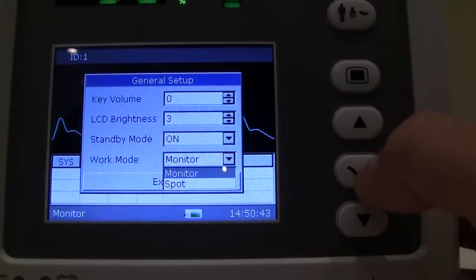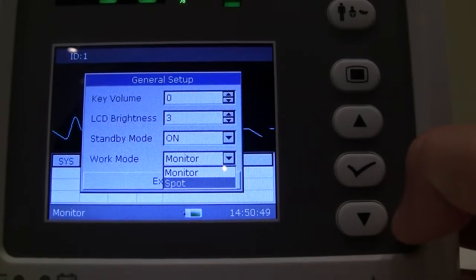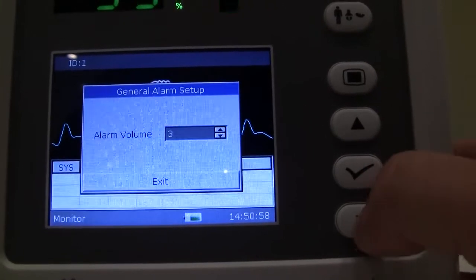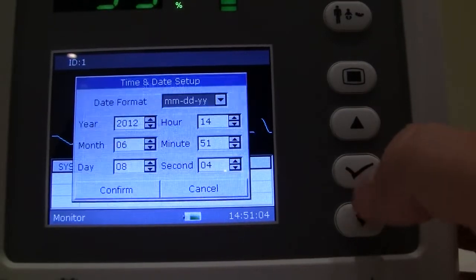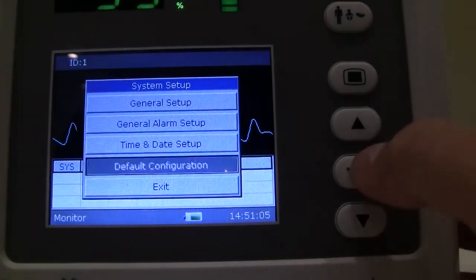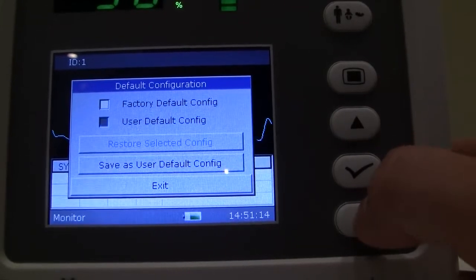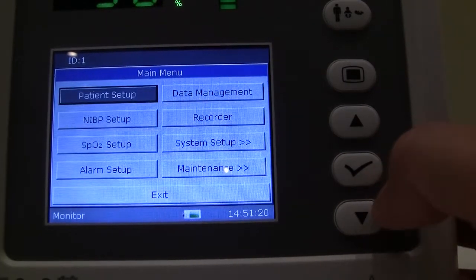Work mode is very important. Right now it's set to monitor. You can see that you can also select it as a spot vital signs monitor. If you're going to be using this device simply for checking in patients, you would want it on spot, and if you want it on for continuous monitoring, you would put it on monitor. General alarm setup is where you would change your volume for your alarm. Date and time, pretty self-explanatory. This unit obviously has been configured for the proper date and time. Default configuration, you can restore factory default settings here if you so choose, or user default configuration would save any of the previous screens that we just went through. So we'll leave that in user configuration.